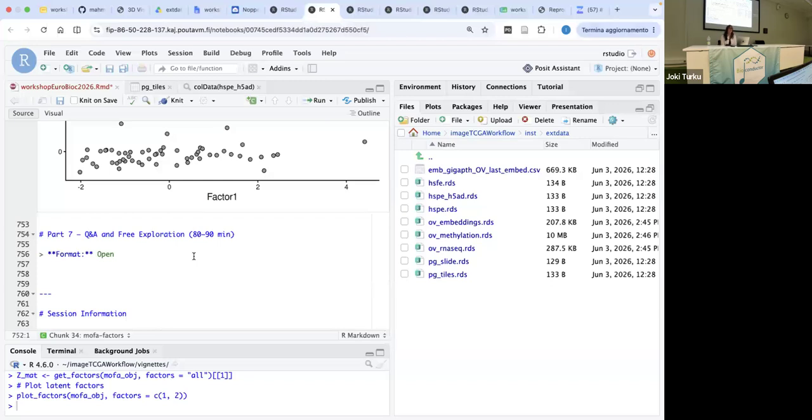No, the number is established by the models, like the foundation model. Every time you run it again, you have this specific type because it's a pre-trained model that uses autoencoders and decoders. One of the interesting things about these embeddings is whether one embedding has a particular meaning.